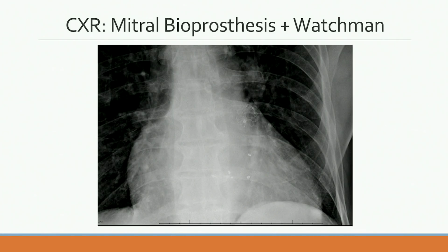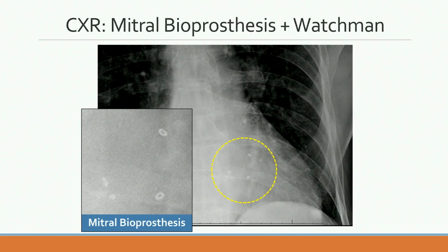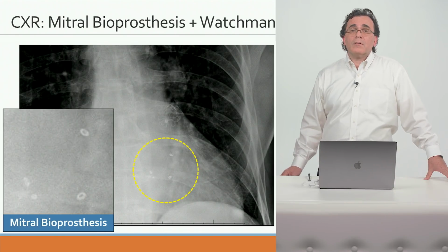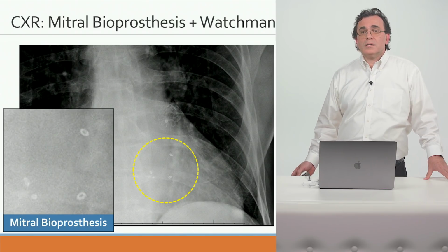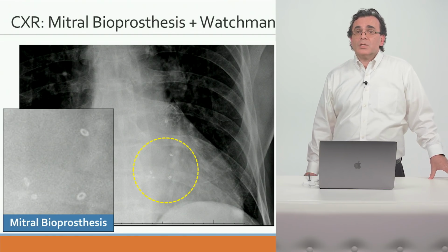And let me just show you a chest x-ray of this patient and what I mean by the lack of radiopacity of this prosthesis. So this is a chest x-ray of this patient, and I will blow up two parts of this image. So this is his mitral bioprosthesis, and you actually see there are only 3 radiopaque markers on this bioprosthesis, which are at the tips of the struts and away from the sewing ring. And it is at the sewing ring that the paravalvular leak occurs, and it's at the sewing ring level that the paravalvular leak closure will be performed. So therefore, these markers do not provide us with the fluoroscopic location of the sewing ring.